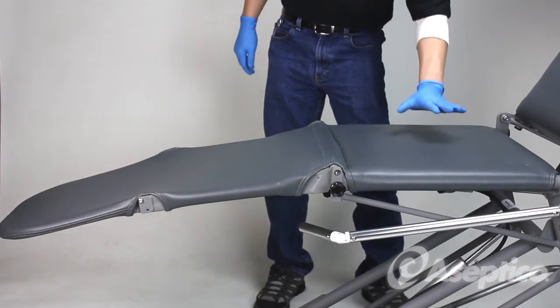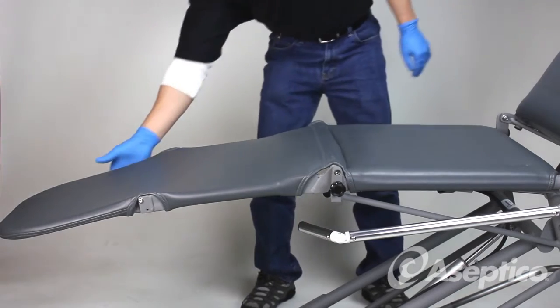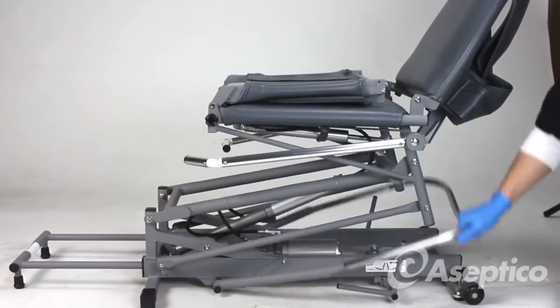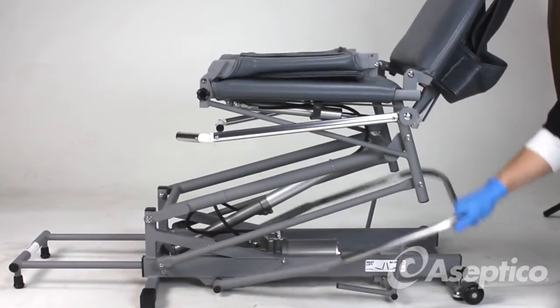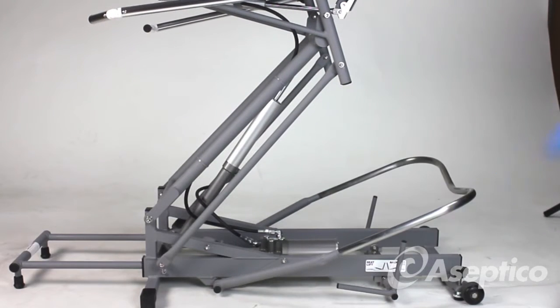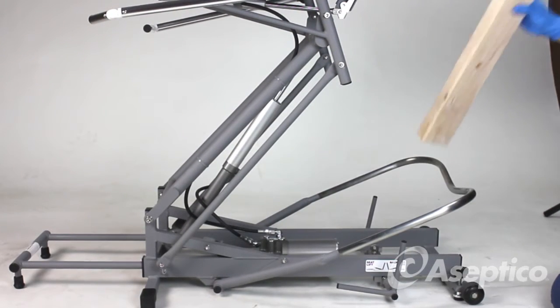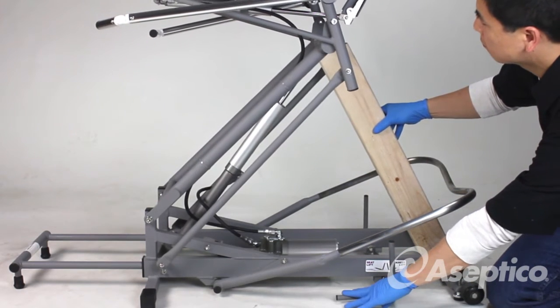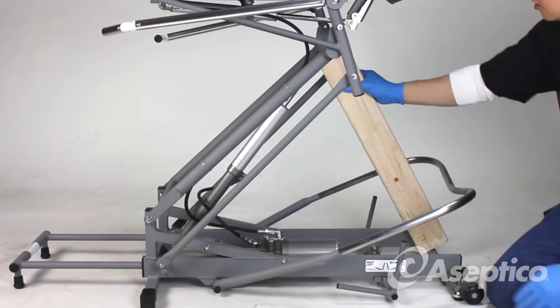Remove any weight from the seat, fold the footrest in, pump the chair up, and use a prop such as a 2x4 that's about 2 feet tall. Then release and bring it back down. Make sure it's secure.